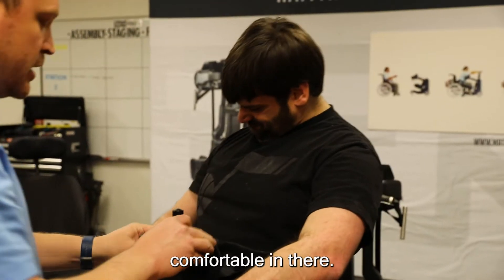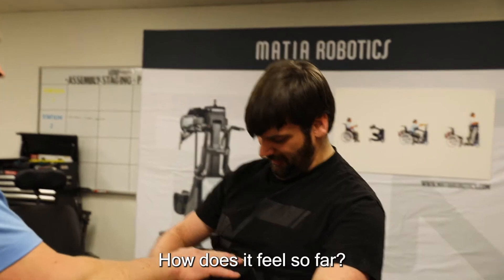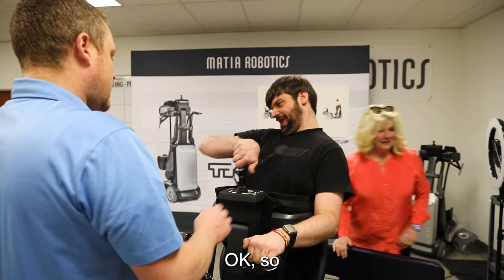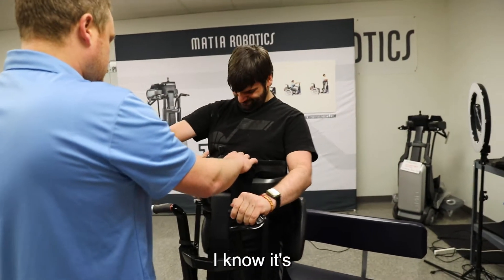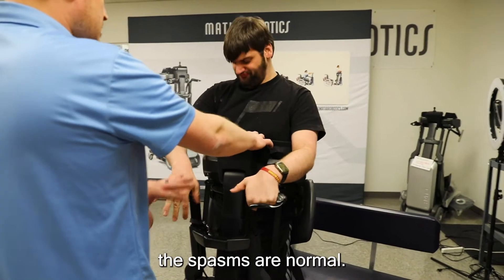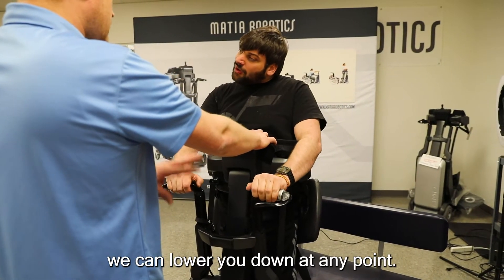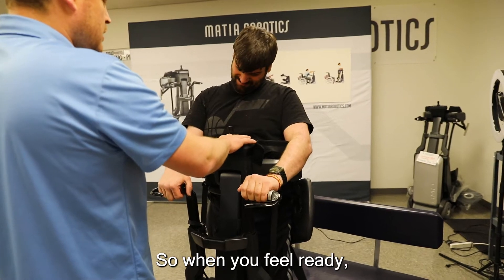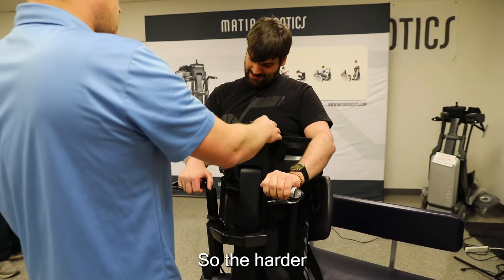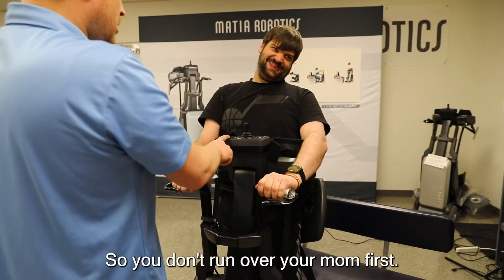The other thing I'm going to have you do is lean forward a little bit. Let's get this nice and snug so you feel more comfortable in there. How does it feel so far? Good. I know it's an adjustment sometimes if you haven't had your muscles straight for a while — the spasms are normal. If you start to feel uncomfortable we can lower you down at any point. The joystick is going to be the same as the joystick on your wheelchair, proportional, so the harder you push the faster you go, but there's a top speed and I've slowed it down so you don't run over your mom on the first try.